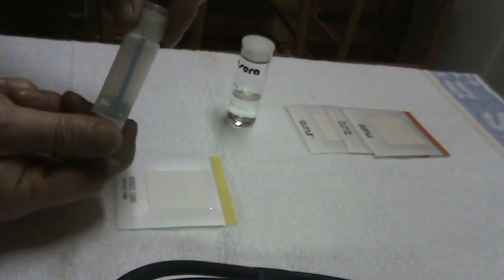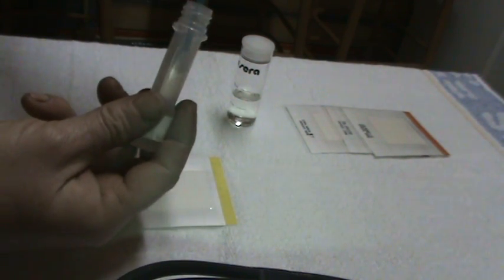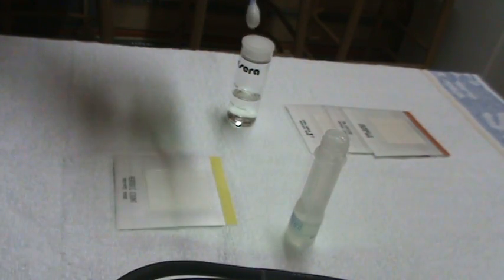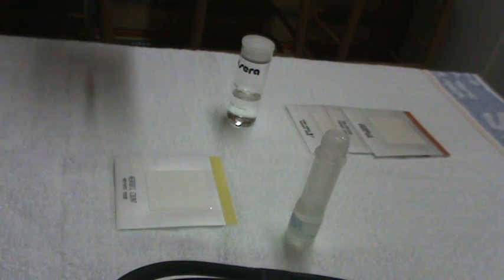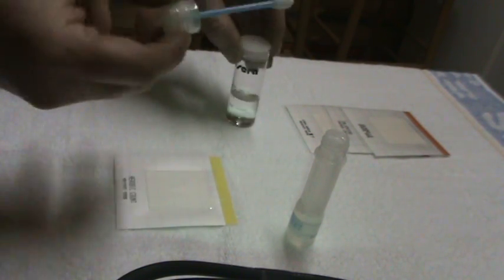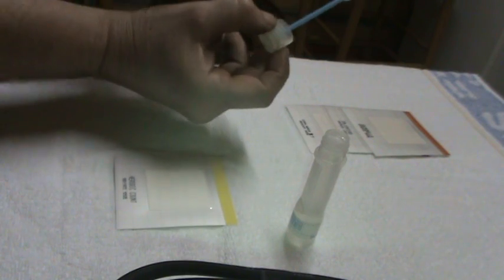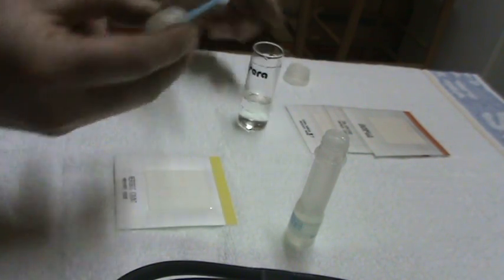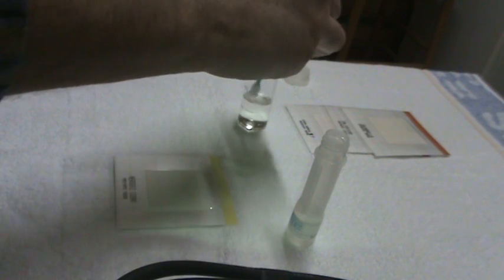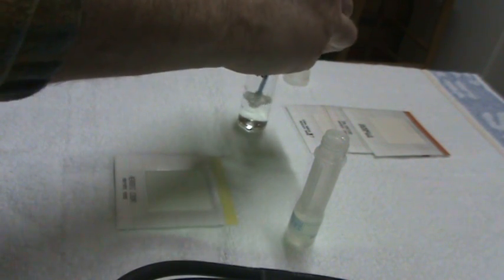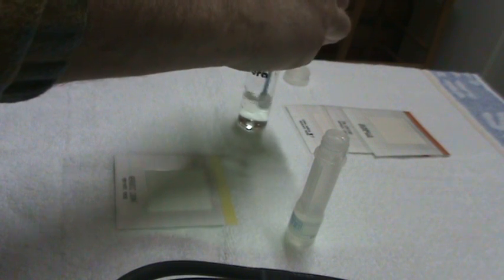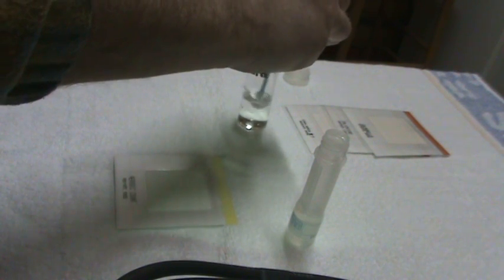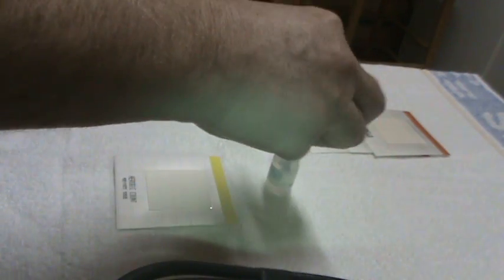This is a swab. Unscrew the cap of the swab. Just shake it out, so all the liquid is out. Put it in the sample of water from the pond, turn it a little so it takes up the water from the pond, and put it back in.